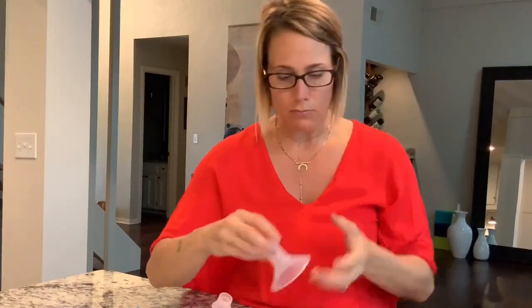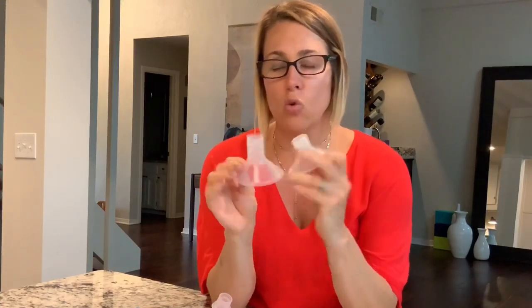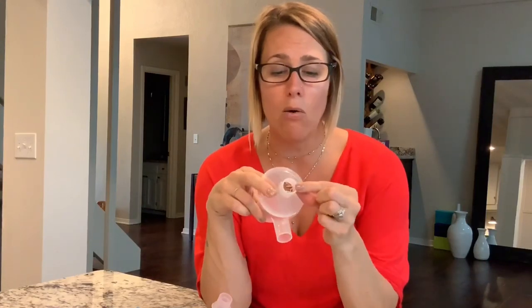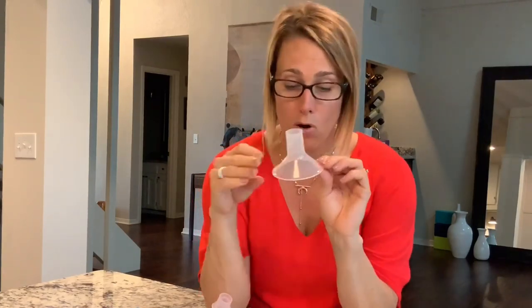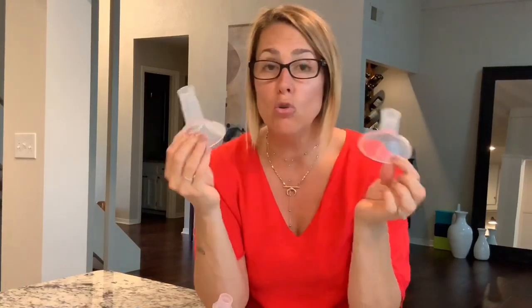Let me show you a few here. We have the 21 millimeter with Medela and the 24. The 21 millimeter is rarely used — I've been working with breastfeeding moms for about 15 years and this one rarely is needed. It doesn't allow a lot of expansion through the tunnel or lengthening. The 24 and 27 millimeter flanges typically come in the kit with your pump, and usually one of these two works for most moms.